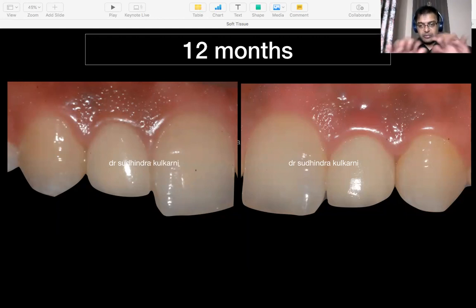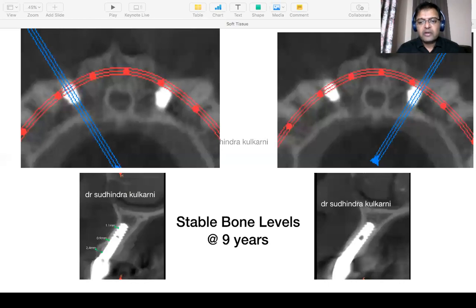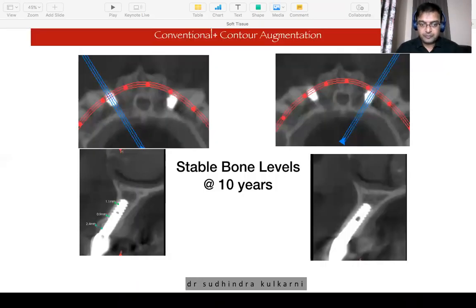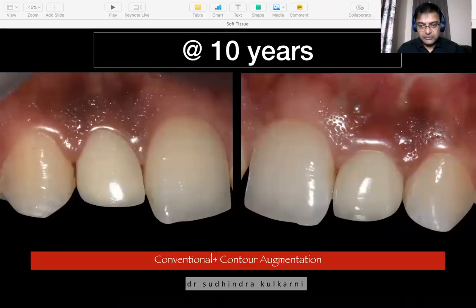That gave a good amount of blood supply to this graft, and that's why you see a wonderful amount of soft tissue thickness. And what you see is also the underlying bone levels in this area. It's absolutely stable at 9 years, and this is at 9 years post. You see here that the gingiva or the mucosa around both these implants looks so beautiful. It looks emergent, the teeth look alive, and that's what we want. So this is a case where you do a free connective tissue graft much later in the life of an implant. And this is at 10 years.